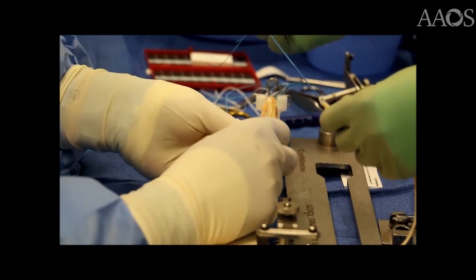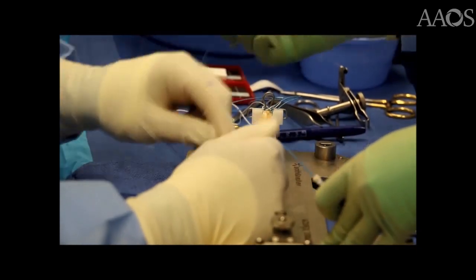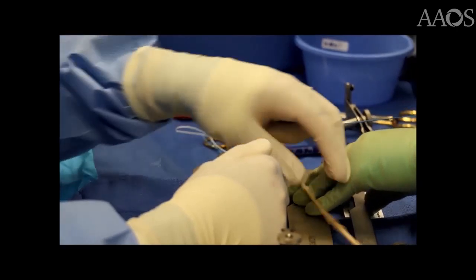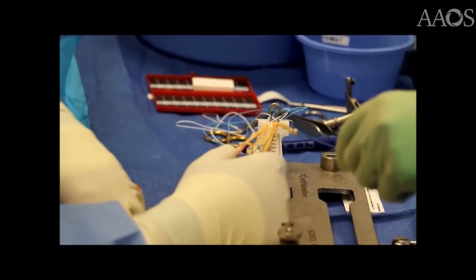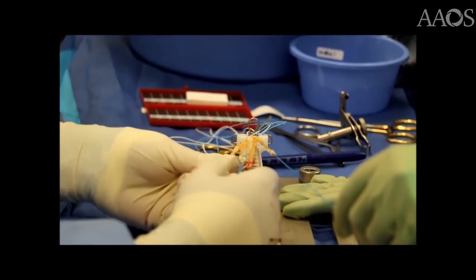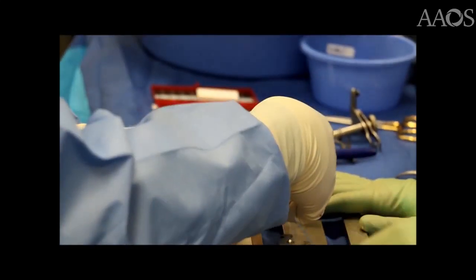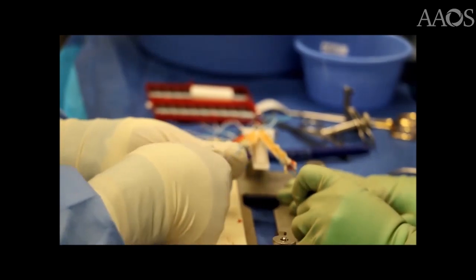Allograft tissue was provided by LifeNet Health and all grafts were sterilized using the Allowash XG process, including 1.2 to 1.9 megarads of irradiation. A cortical suspension device was added to the looped end while the free ends were pulled to tension using a graft tensioning device.